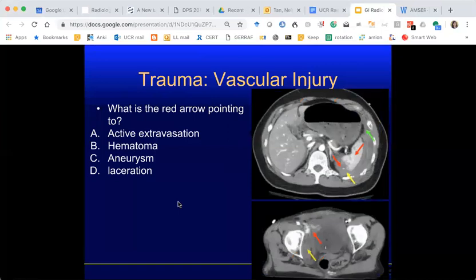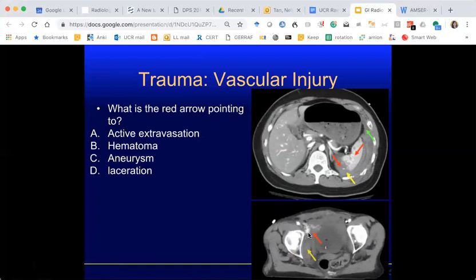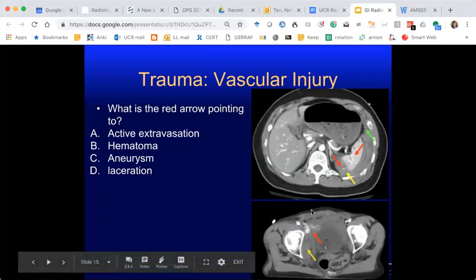This is a patient who is status post MVC. What do you see at the red arrows? This is another contrast-enhanced CT — we know because the vessels are bright. The consensus is active extravasation — this bright contrast here is outside the lumen.